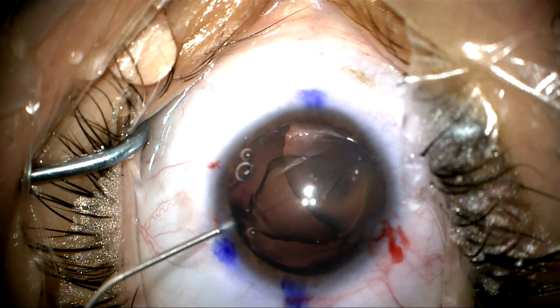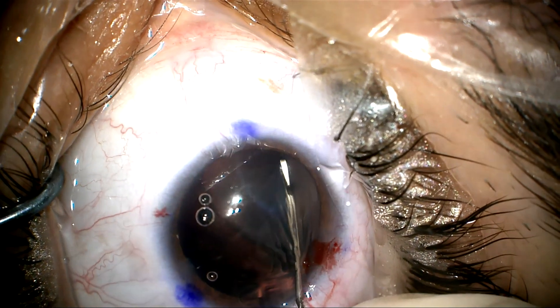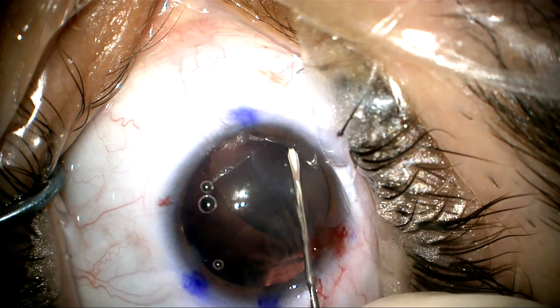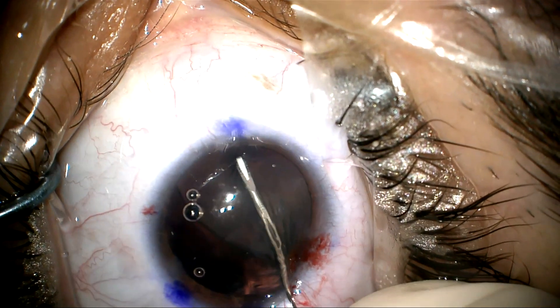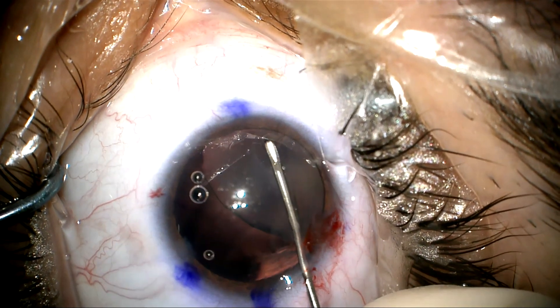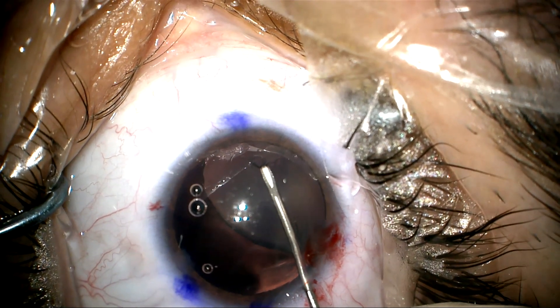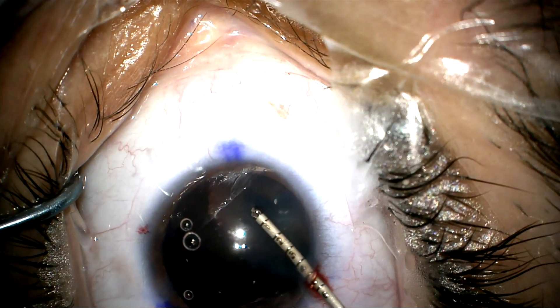We then add more viscoelastic and we're going to try to start the capsulorhexis here. We're using a cystitome and you can see it's a bit difficult to puncture the anterior capsule, but we're able to get the capsulorhexis started. We want to start as close to the middle of the lens as possible so that there's less chance of this tearing out.